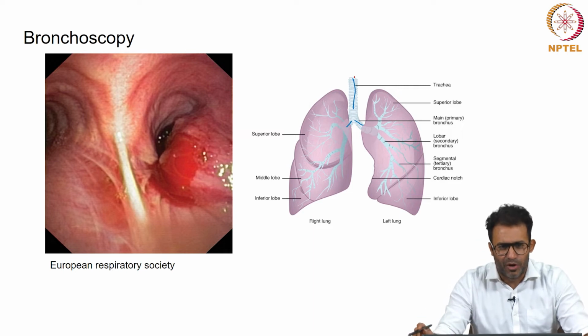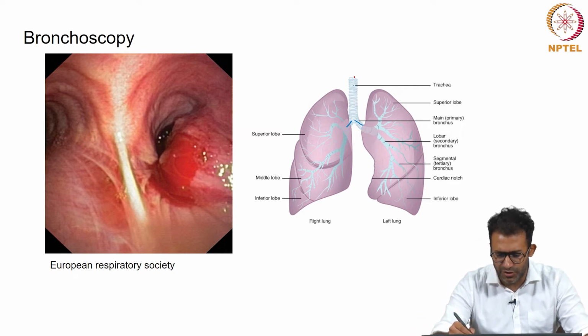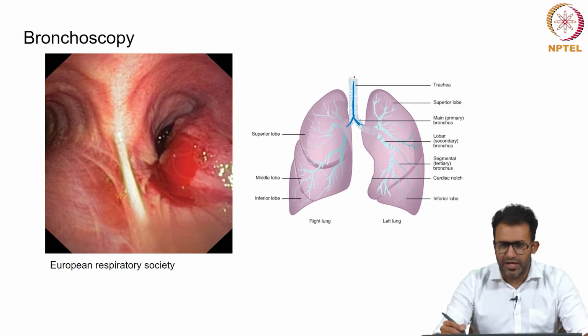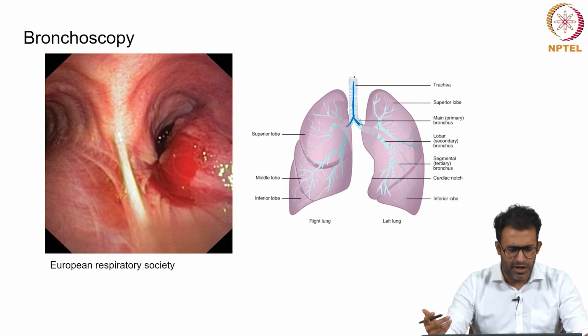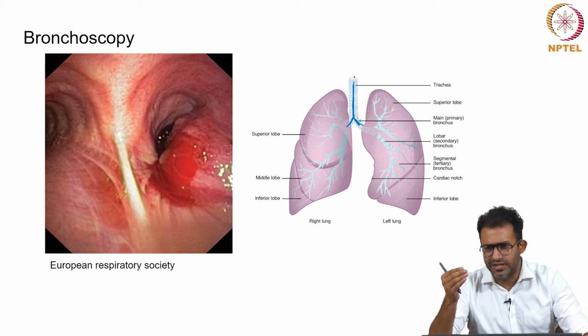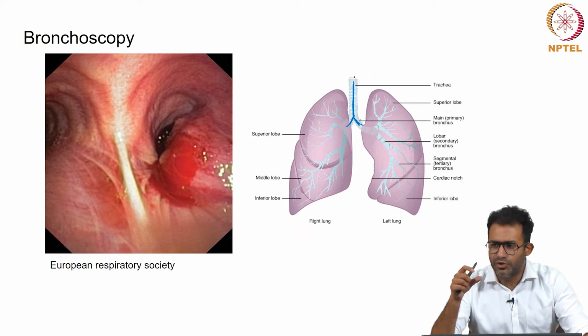So what we see here is a bronchoscopy. Bronchoscopy essentially involves passing a tube through your windpipe. This bifurcates into what we call the bronchus, and you are able to visualize the inside of your windpipe. So this is a very important modality in diagnosing and even ruling out problems such as early lung cancer, and also removing foreign bodies. Again, like any form of endoscopy, it can be either diagnostic or therapeutic. When I say diagnostic, it means you're trying to find out what the problem is. When I say therapeutic, I mean I'm trying to treat the problem.